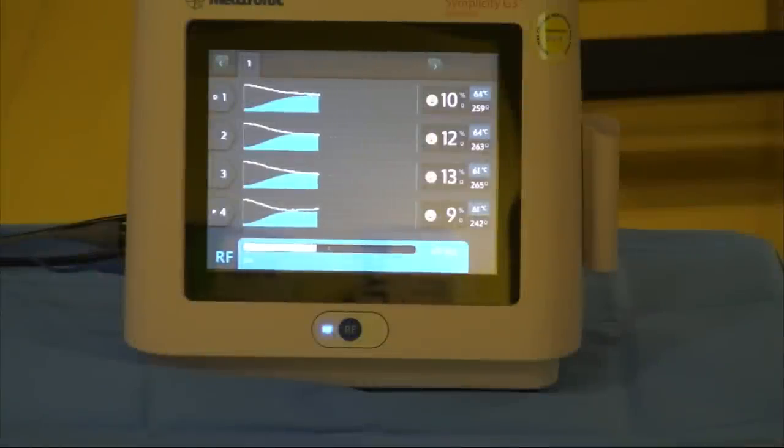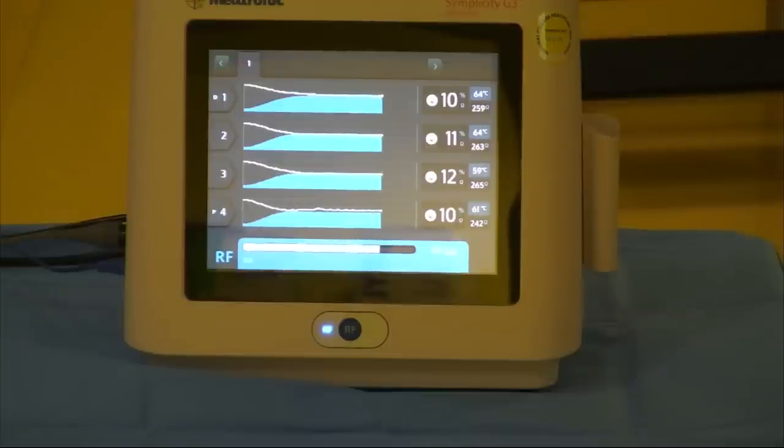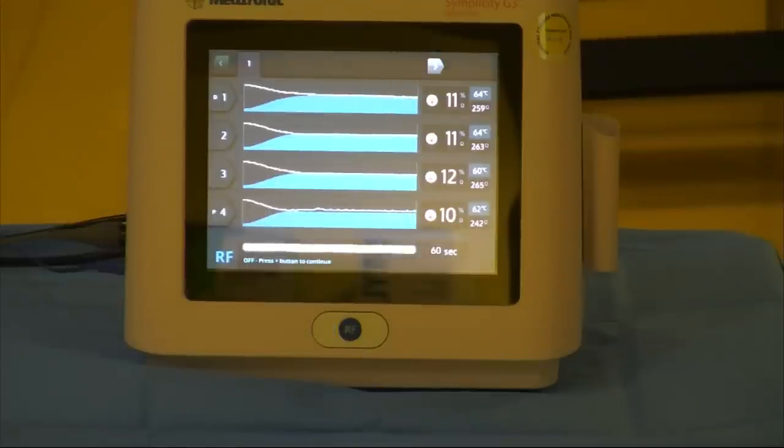Colin, you can see these numbers changing at your end? That's fantastic. I think we'll be in the advertisement leaflet on the company tomorrow. Perfect reduction of all four and super stable temperature, 50 lines, 60, 61, all four. Is it true or are you making it up? No, I can assure you it's true. But I don't think this gentleman is going to be running a marathon tomorrow. The follow-up period is about a year here, so we'll see how it goes. But certainly from a technical perspective, it's very straightforward.